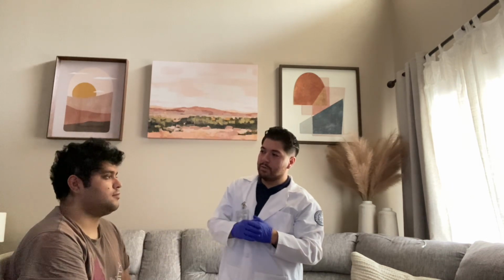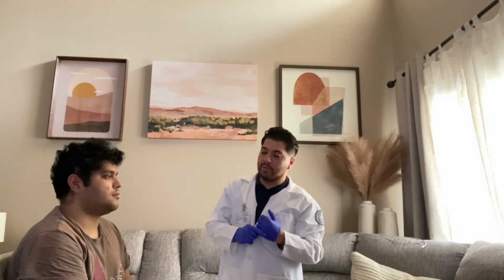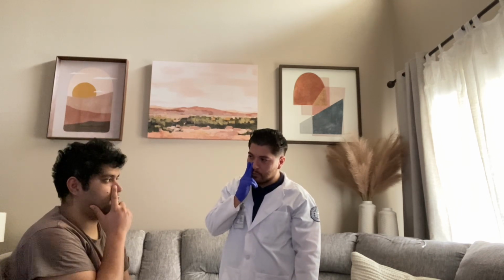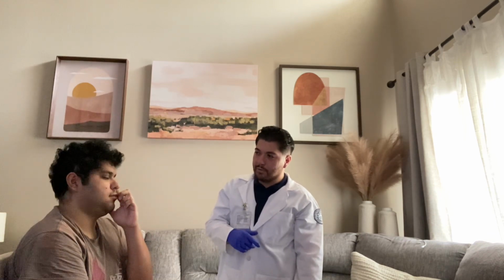Again, we look at the general nose, make sure to look at the surface, looking for asymmetry, deformities, and test for obstructions. Can you cover your right nostril and breathe? Are you able to breathe? Okay, now do the same with the other one. You can breathe, okay. And now we can use the otoscope again.